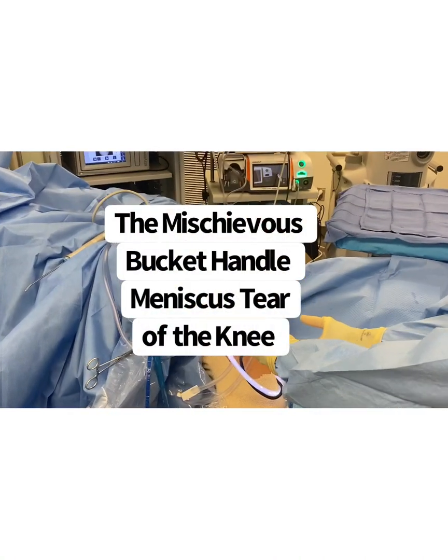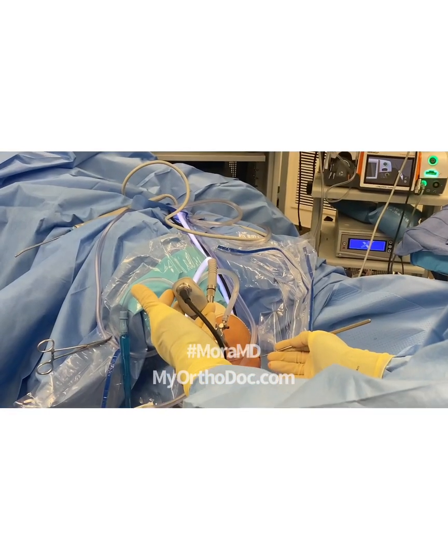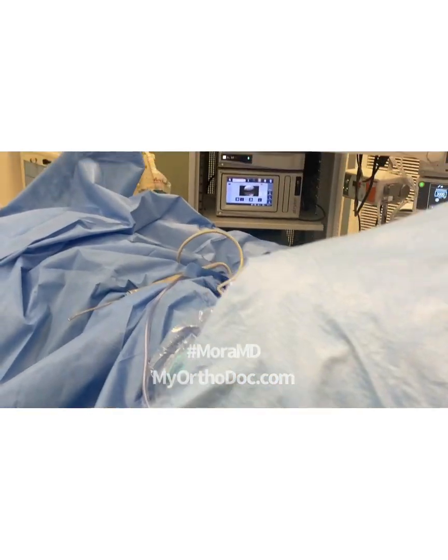Knee, right knee, camera on the side. This probe goes on the other incision over here. Then we look at the screen. This is what we have on the screen.